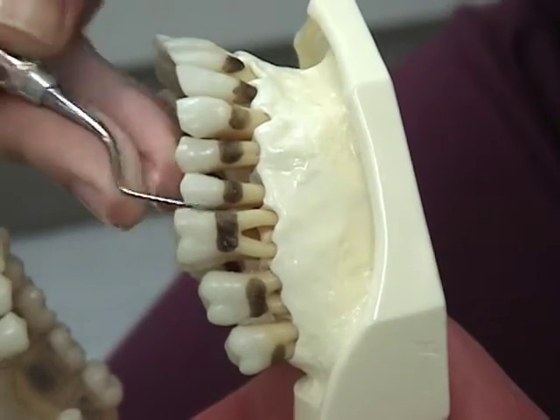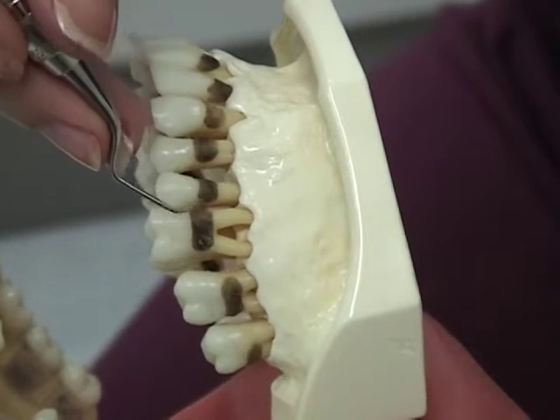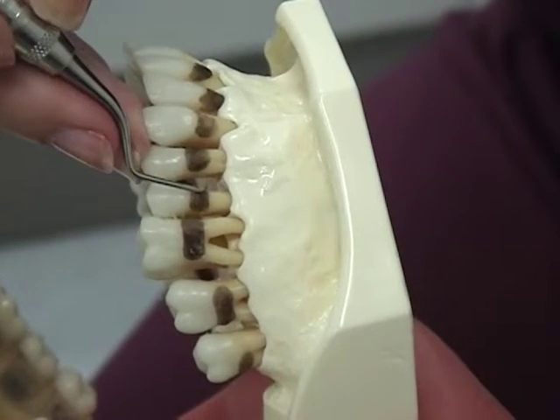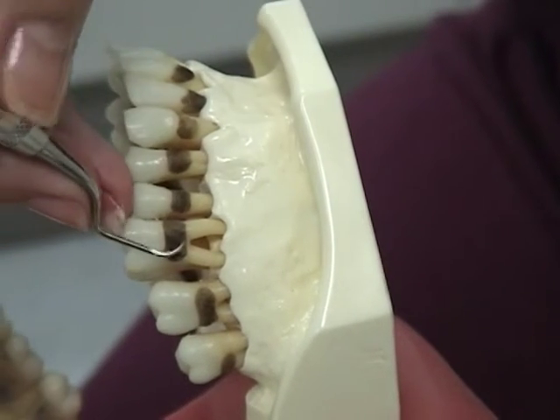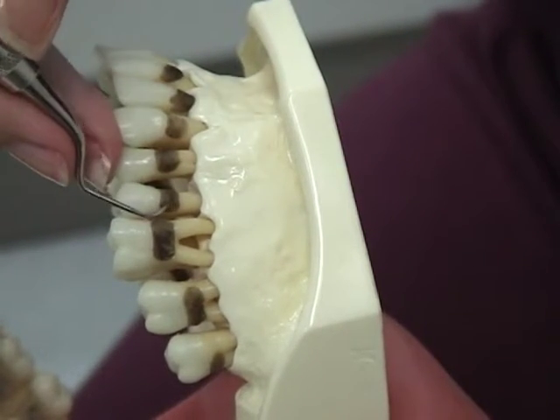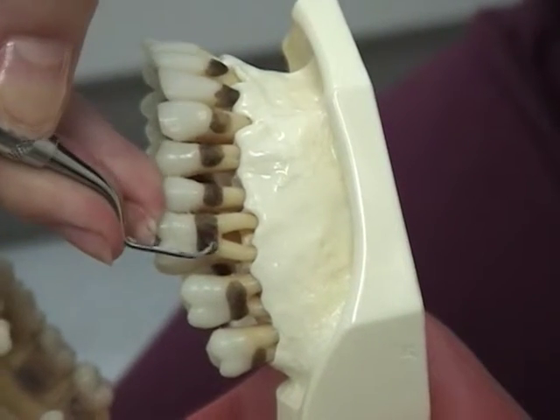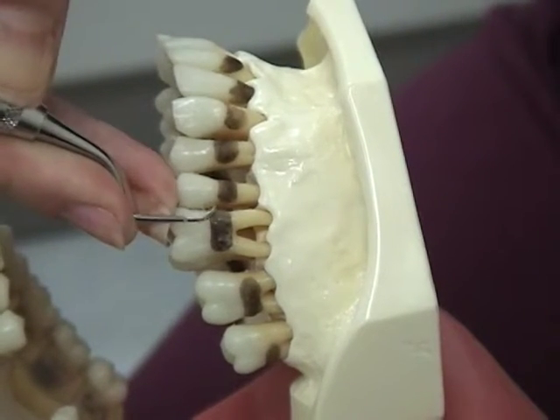If you fly off the tooth, you did not stop the stroke by pressing down on your fulcrum. Watch the clinician as she demonstrates the assessment stroke and then the working stroke. For this demonstration the clinician will not be wearing gloves, enabling you to see the blanching of the fulcrum on the working stroke and the lack of blanching on the assessment stroke. The assessment stroke is a much smoother, more gliding stroke as she feels surface irregularities through the instrument tip. On the working stroke, notice how she presses down firmly on the fulcrum and uses a shorter, more powerful stroke with continuous wrist motion.